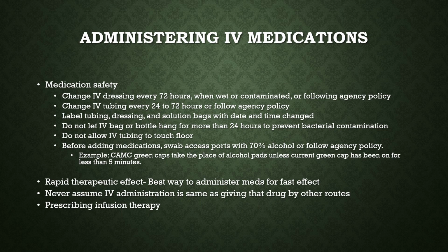Bags maybe you don't see touch the floor so much, but tubing, I can't tell you how many times patients will drag the tubing along or the staff will. One time I saw the tubing fall onto the floor, and an attendant with a patient on a carrier ran over that tubing and just sliced it in half like a knife. So there was that IV tubing on the filthy floor with a big hole in it where it had been cut in two. We had to hurry and get that discontinued on someone who was very hard to stick, because we contaminated the tubing and put a big hole in it by running over it.